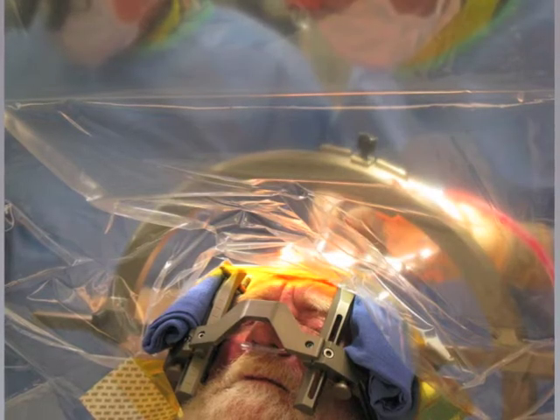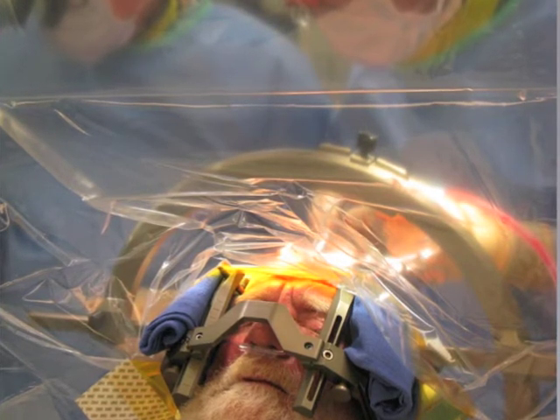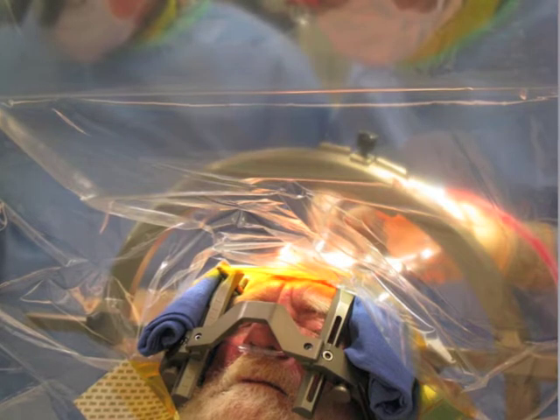Now, because we can't actually see into the brain during surgery in the regular operating room, we do this technique where we put a small little listening electrode into the brain first, and we listen to the brain activity in the area of these places where we stimulate, and that's how we make sure that we're in the right place. And in order to listen to the brain activity, we need to have the brain awake, and so that's why we have the patients awake.